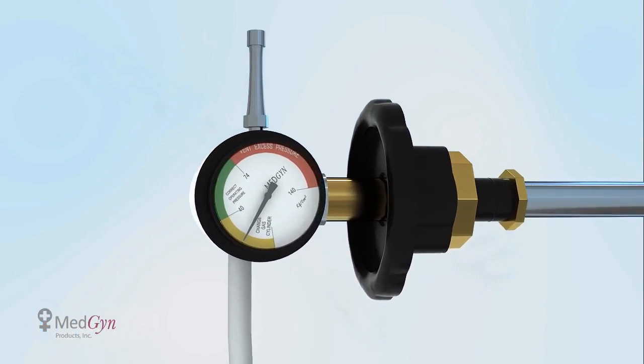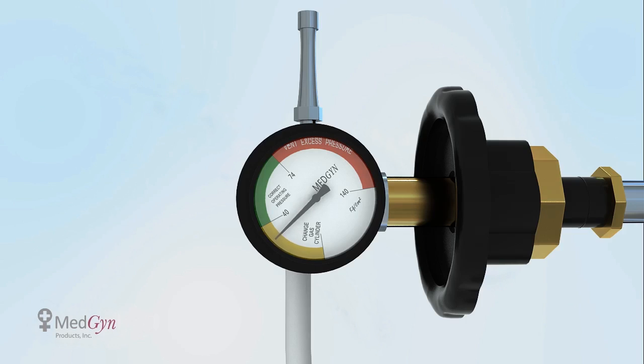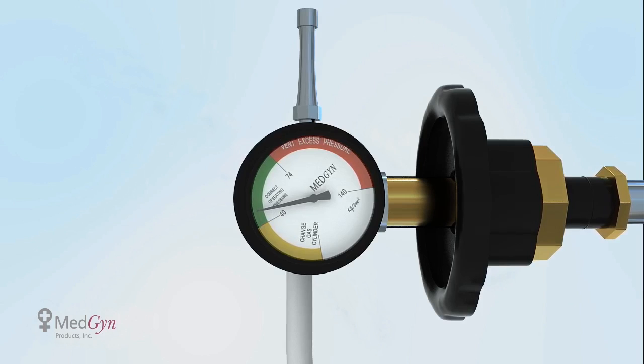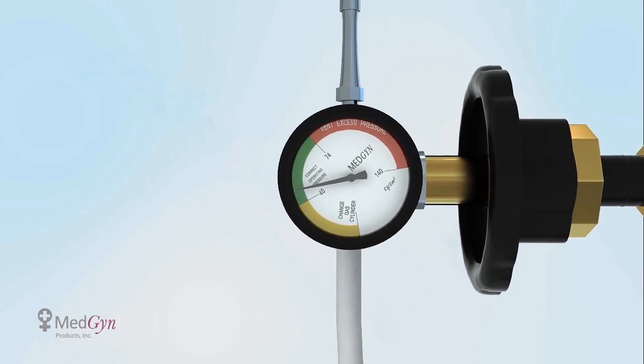The needle on the gauge needs to be in the green area. If red, the pressure is too high to perform the procedure. If yellow, the pressure is too low to perform the procedure.